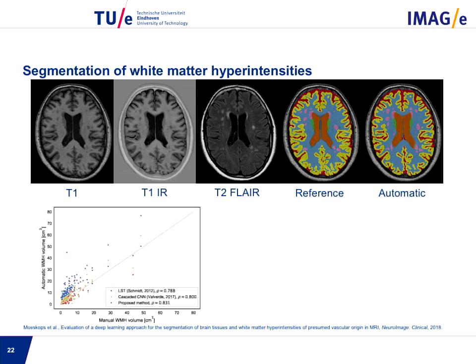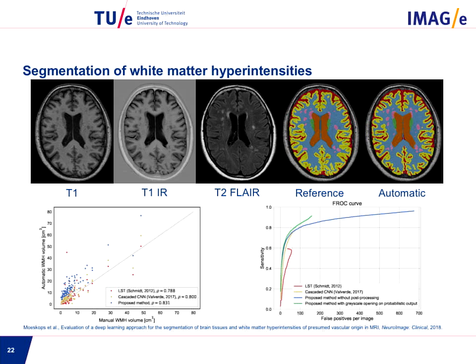And then here I show that the volume of the white matter hyperintensities corresponds well with the manual reference volume. And here I show that it detects most of the white matter hyperintensities recognized in the reference standard as well.